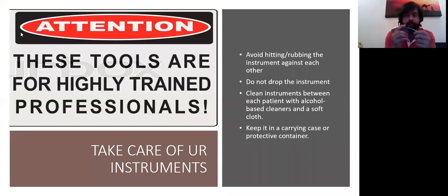The edges should be preserved. If there is any issue with the edges, the patient will feel a lot of pain when you do the IASTM. Do not drop the instrument. Clean the instrument with alcohol rub or with a soft cloth, and clean it with every patient. If you're treating one patient, clean it immediately, then use it on the other patient.